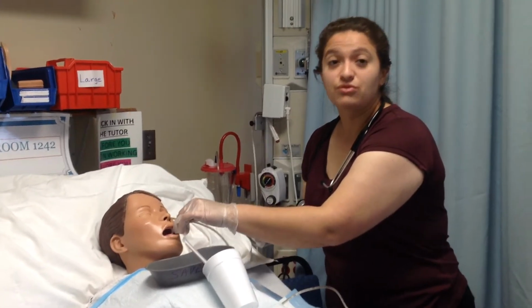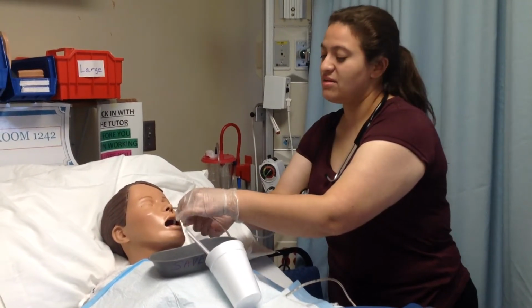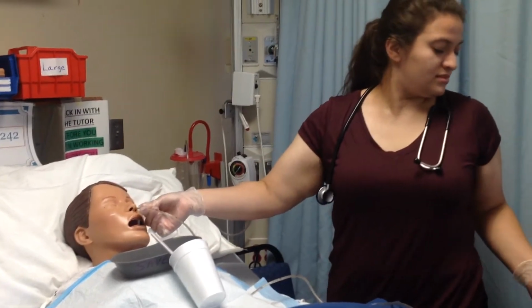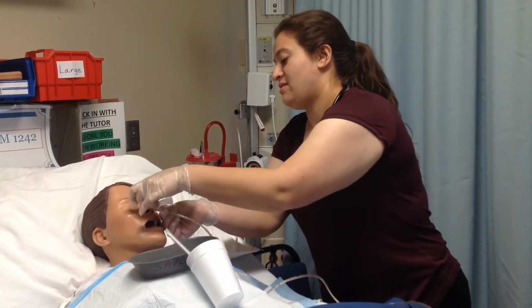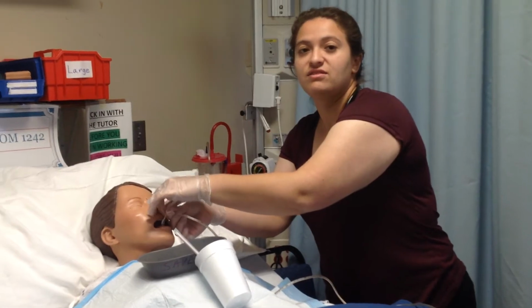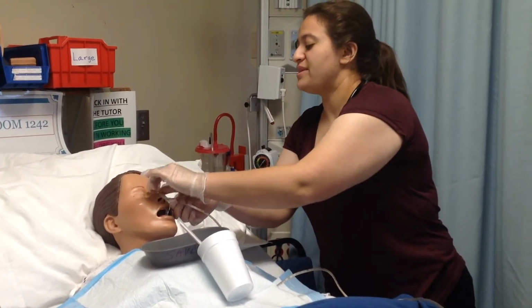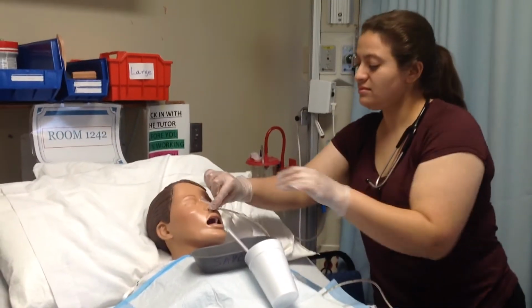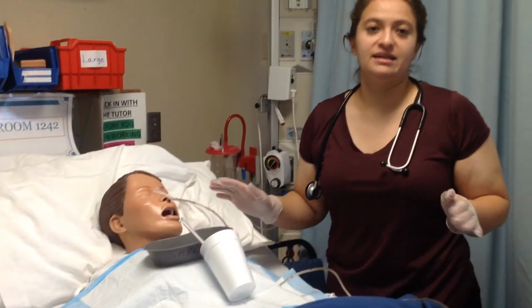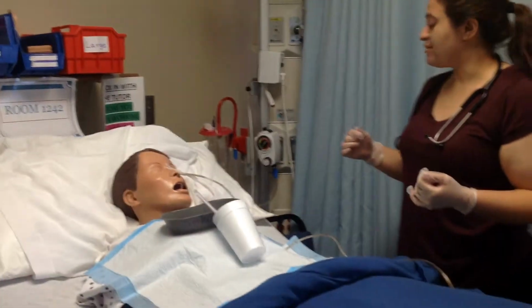I don't want to take my hands off of it at all until I have my tape to tape it down. I would make sure to not let it go at all, because it could move, and we don't want that to happen. So once it's taped down, then I can remove my hands from it.